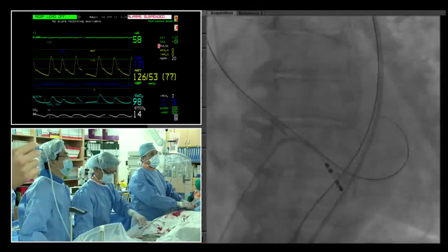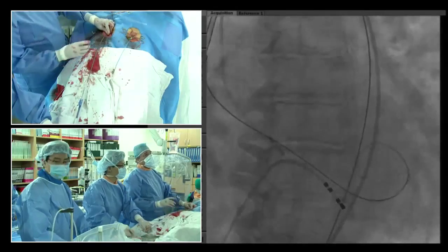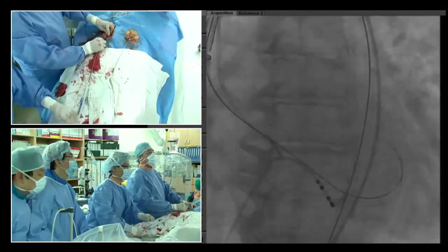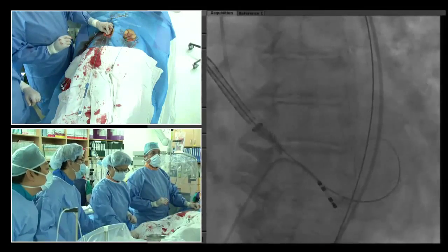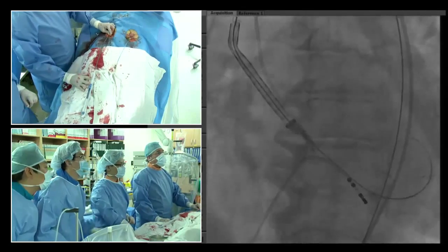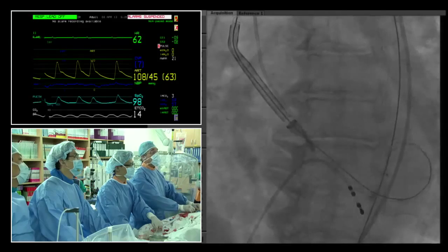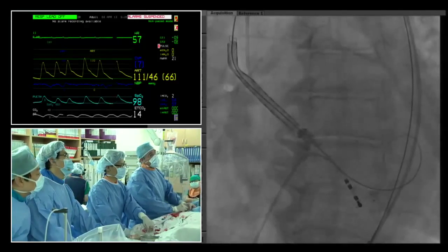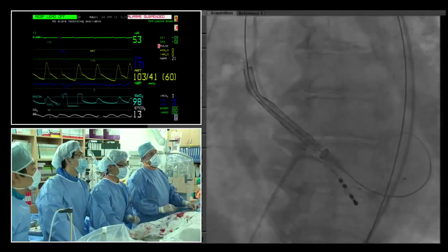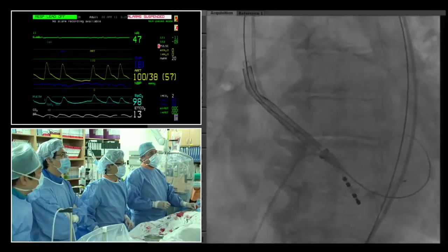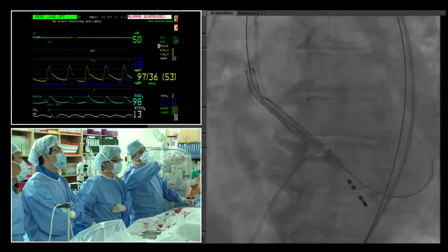The valve has been introduced. Kim will hold the wire in place while advancing slowly across the aortic arch. The operator pulls slightly on the wire to relieve tension, then releases. They are using a fairly LAO projection to best visualize the left main, since the main risk identified is coronary rather than PVL. The valve is oriented so that the hooks face each other, confirming the leaflet plane orientation, allowing the commissure to be positioned away from the left main.